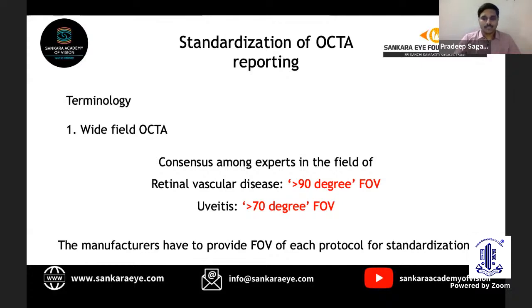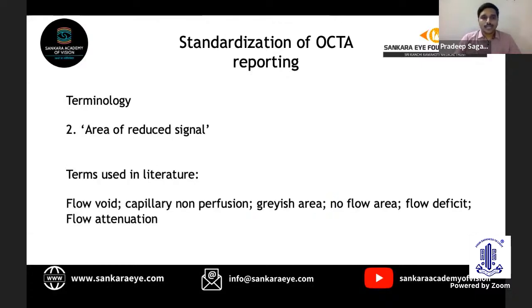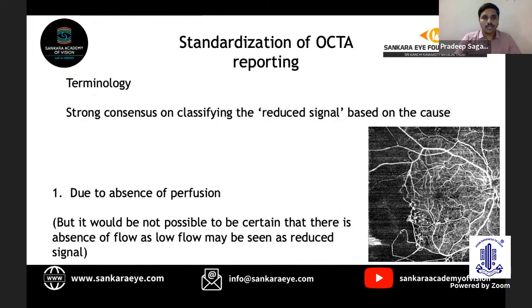The area of reduced signal: we see in OCTA areas with reduced signal, and it has been termed in the literature with various terminologies such as flow void, capillary non-perfusion, grayish area, no flow area, flow deficit, flow attenuation, and so on.